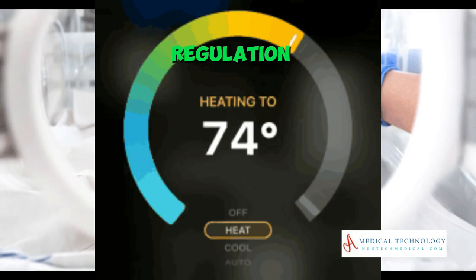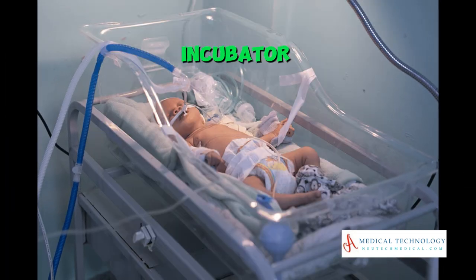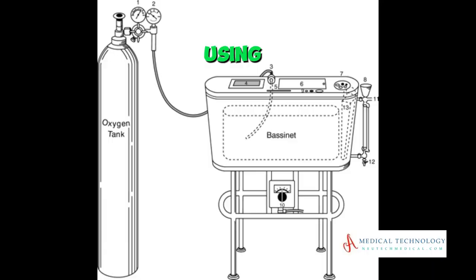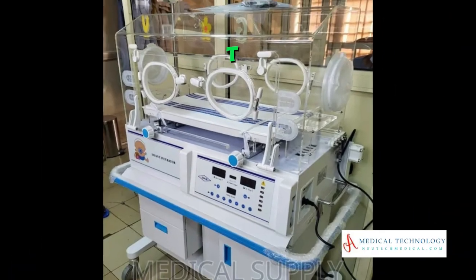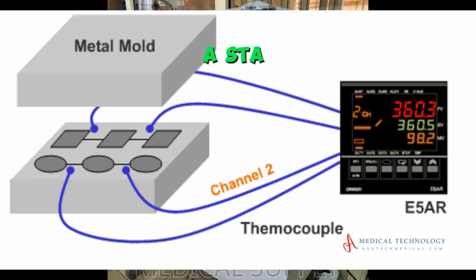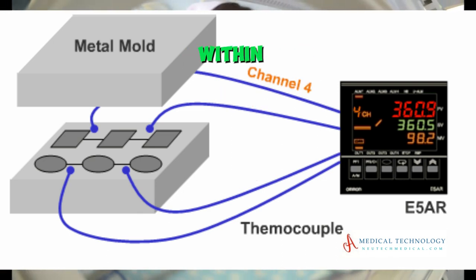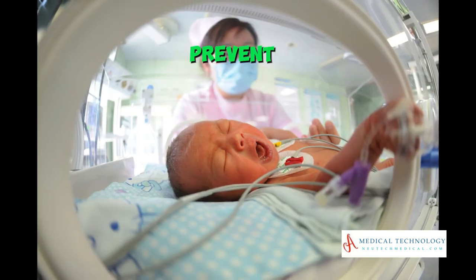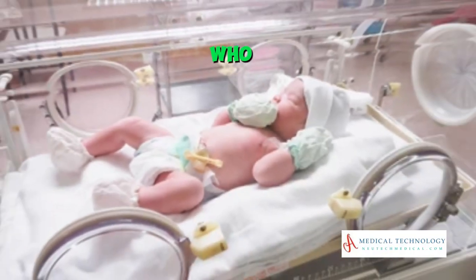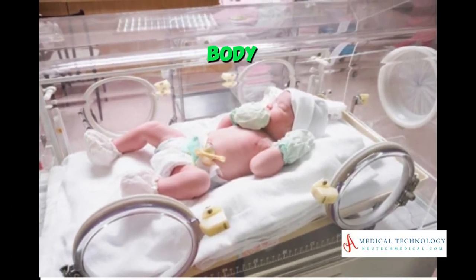Temperature regulation — heating system. The incubator is equipped with a heating system, often using a thermostat-controlled heater. This system maintains a stable and warm temperature within the incubator to prevent hypothermia in premature infants who struggle with regulating their body temperature.